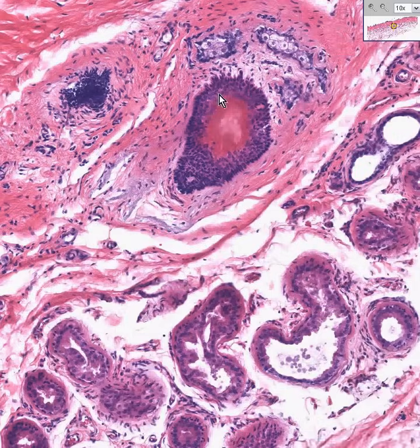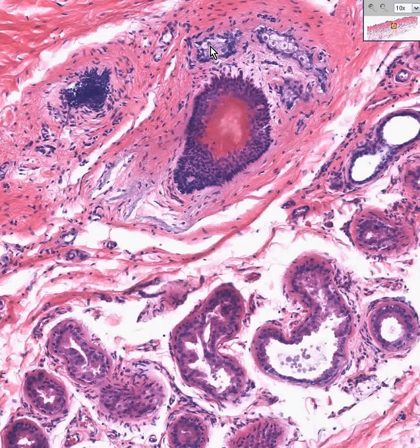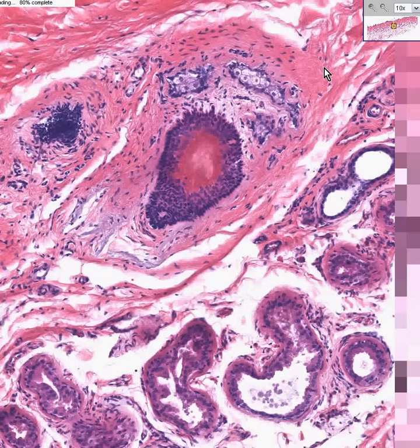And usually in proximity to it, you see clear cells, like you see clear cells with the eccrine sweat glands. But the clear cells in association with hair follicles, all of which release into the hair follicle, are the sebaceous glands.